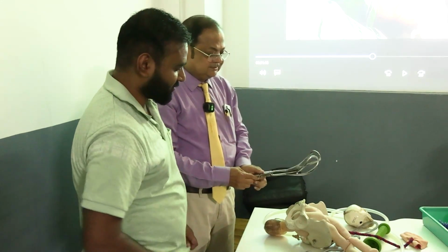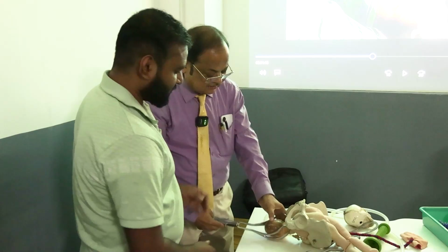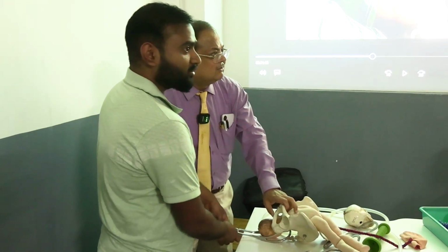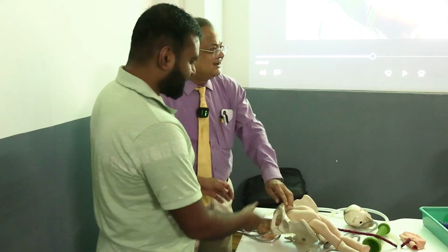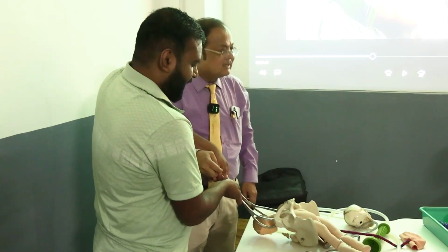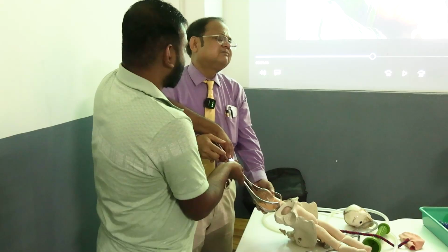First is downward and backward, then horizontal and downward, then upward and extension, upward and forward.